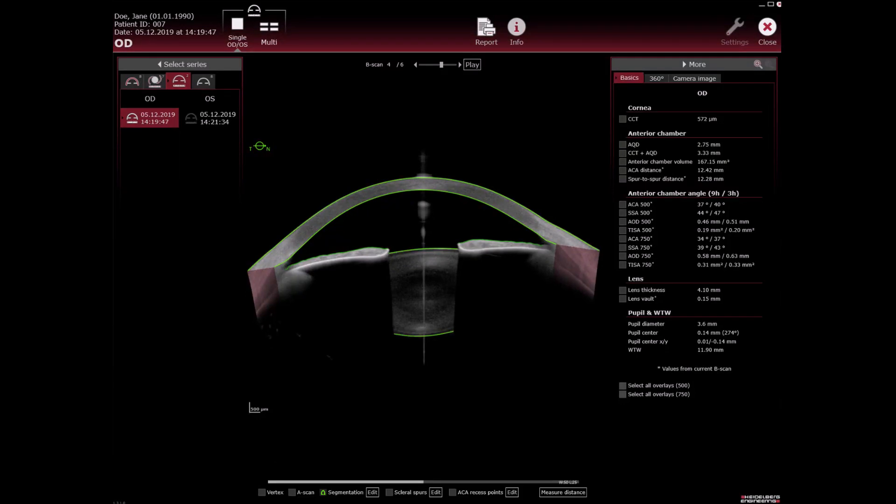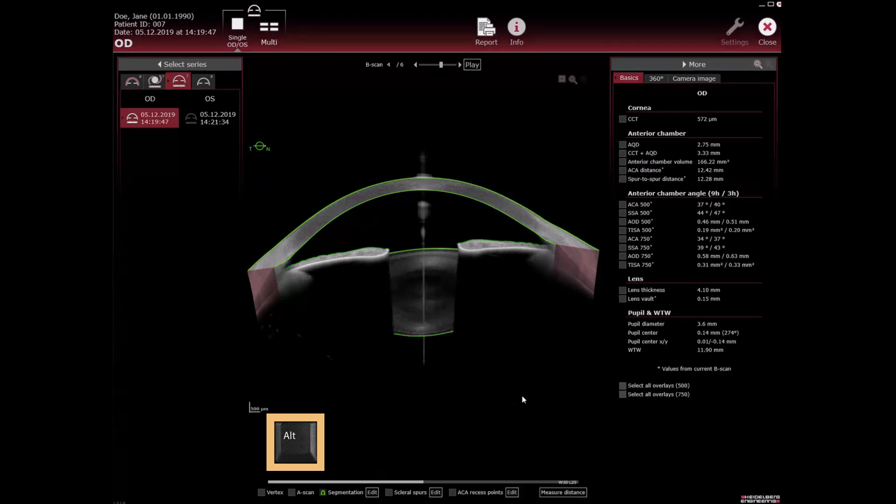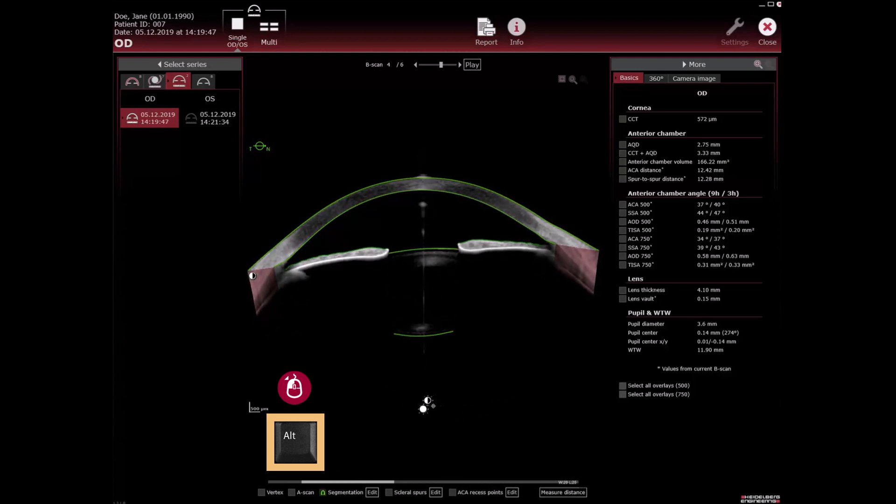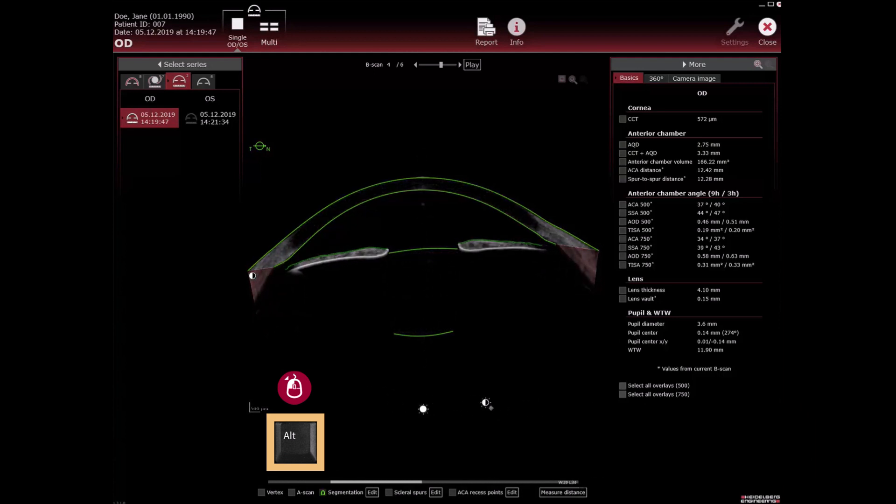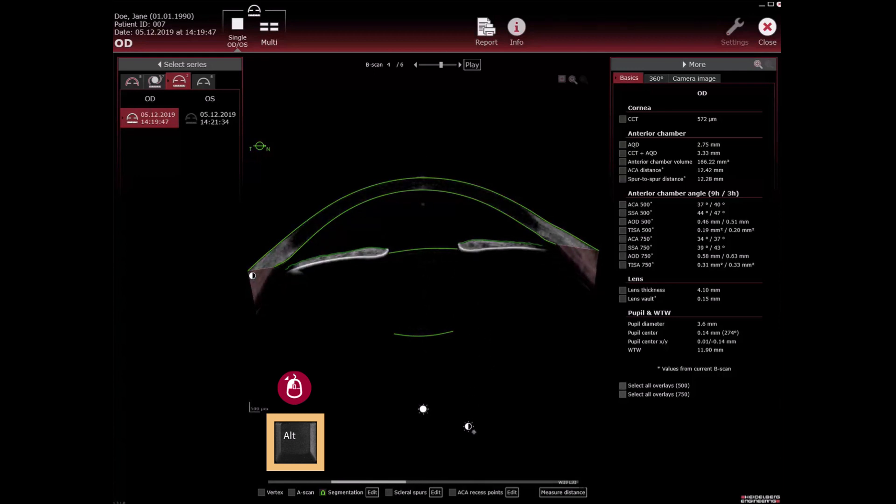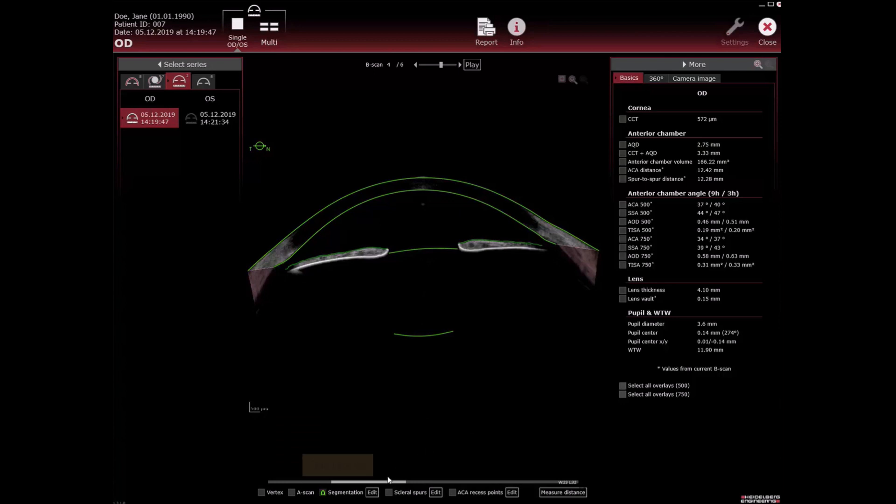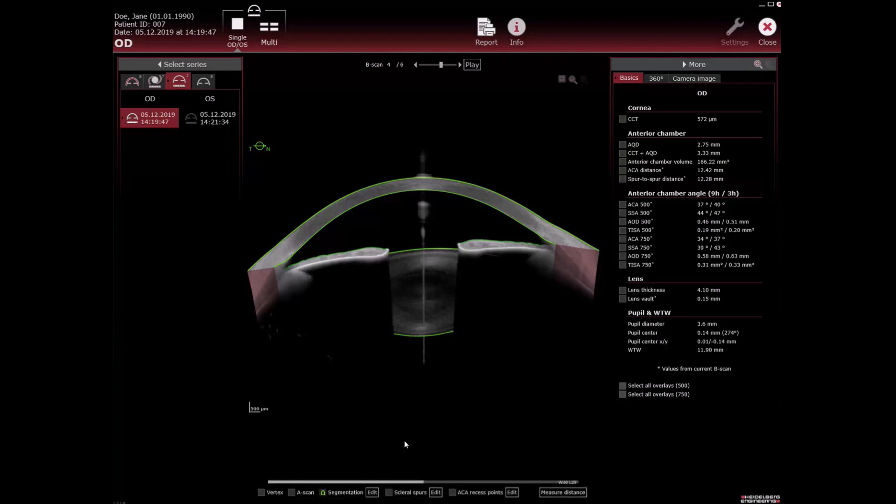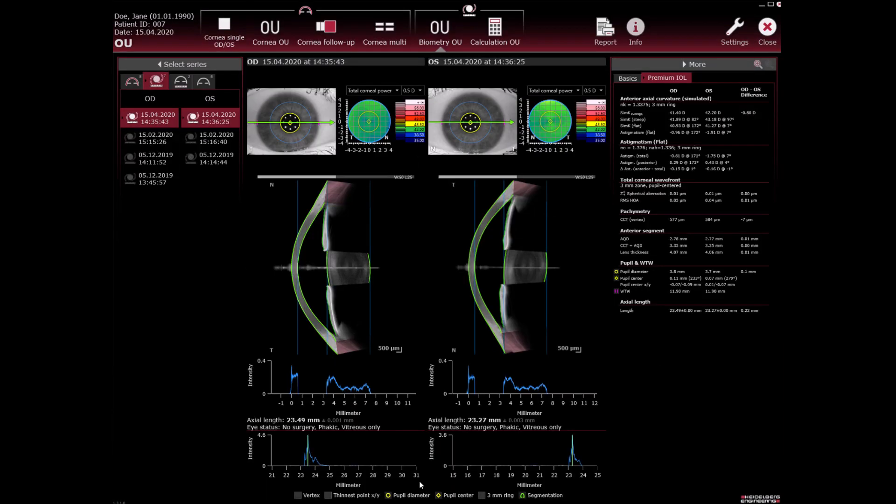Alternatively hold down alt on the keyboard until the mouse cursor switches to the contrast icon. Move the cursor up and down or left and right while holding down the left mouse button to increase or decrease image brightness and contrast. To reset to default values double click the slider.